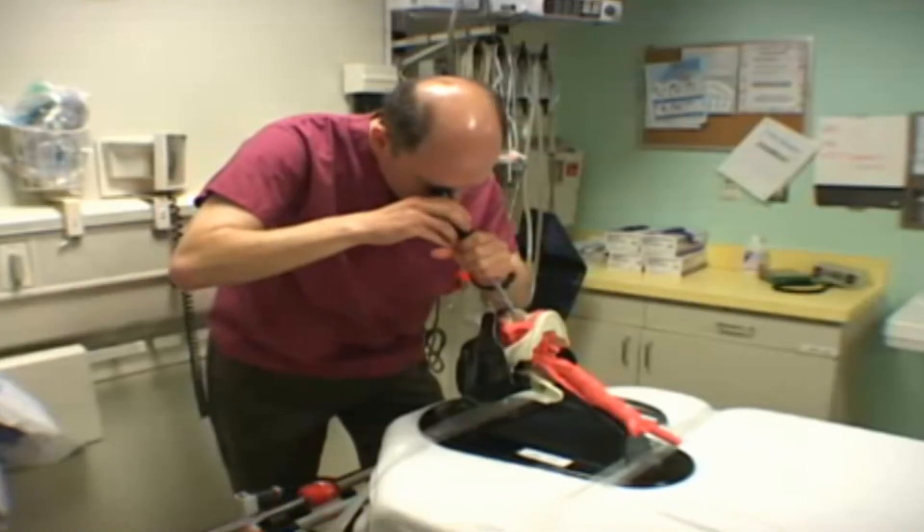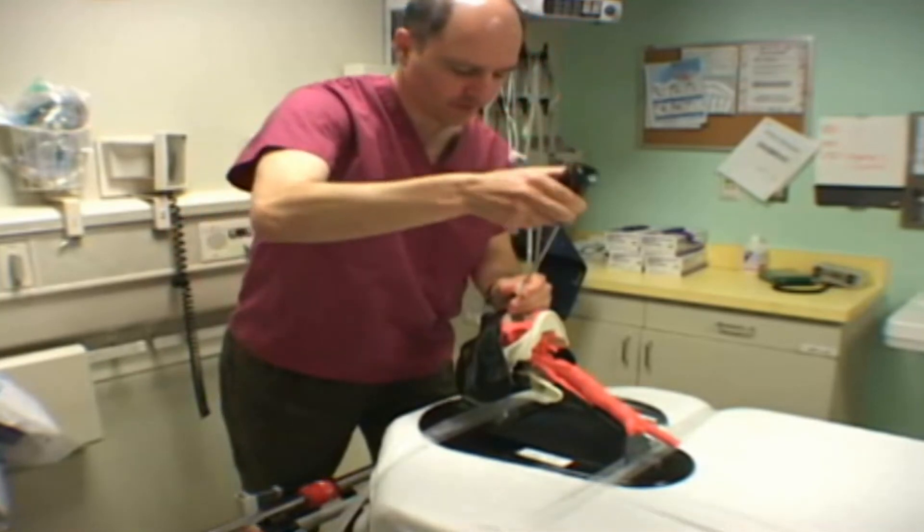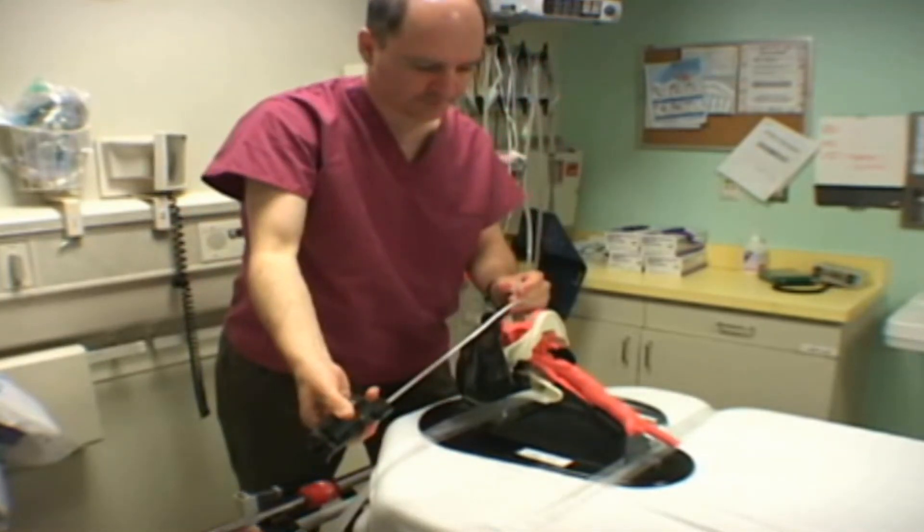The left hand reaches across and turns the tube clockwise off the stylet and into the trachea to the proper depth.